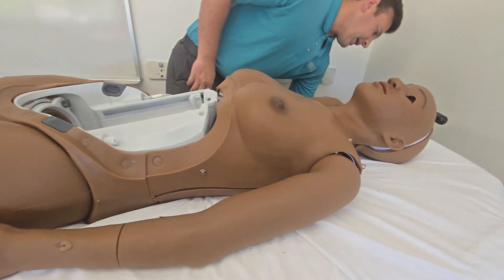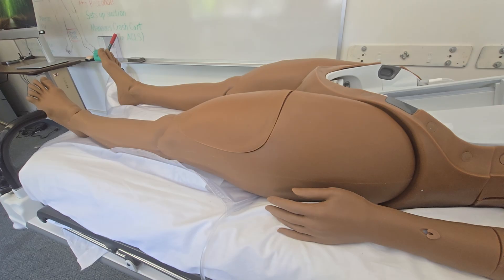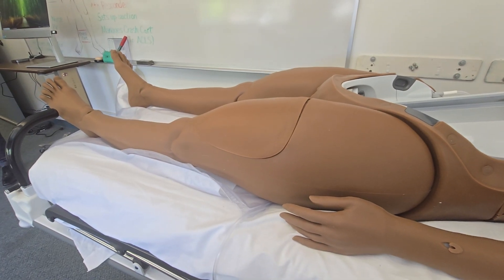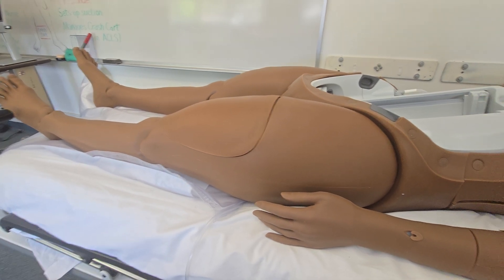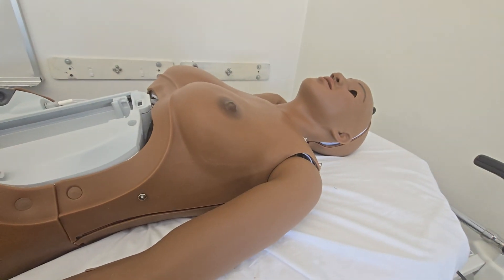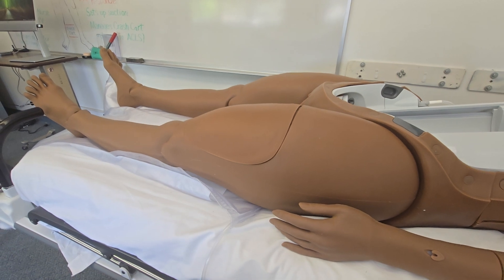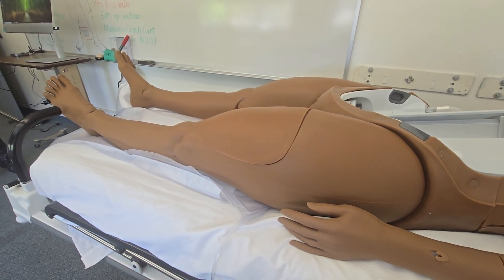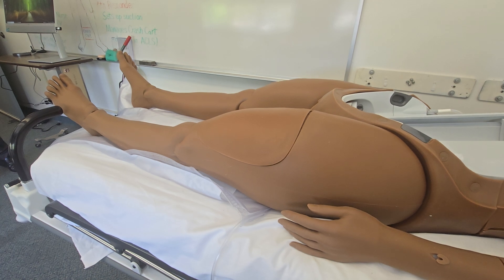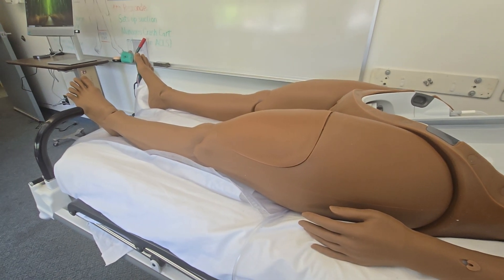I'm going to grab some gloves because we're going to start lubricating everything up. So occiput anterior and occiput posterior type of baby positions during delivery. You also have the breech delivery puck, which as it sounds is mainly just for breech deliveries. And you have the advanced PPH uterus, which we'll go into later — that has to do with postpartum hemorrhage. I'm going to get the pucks out so you can see what they look like.